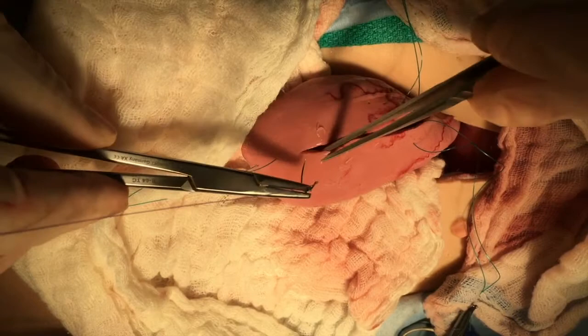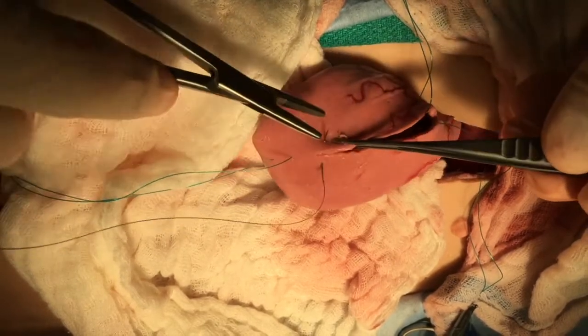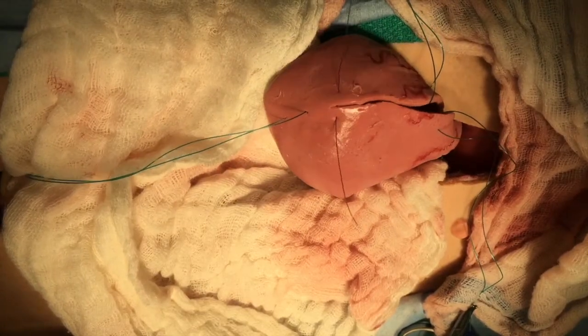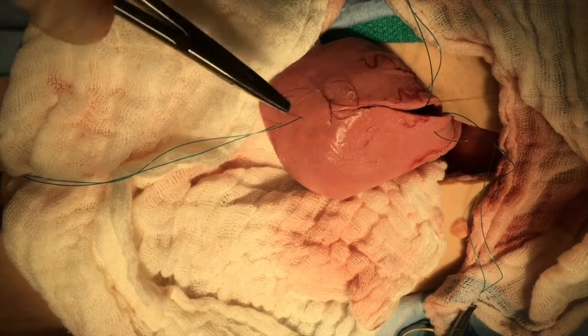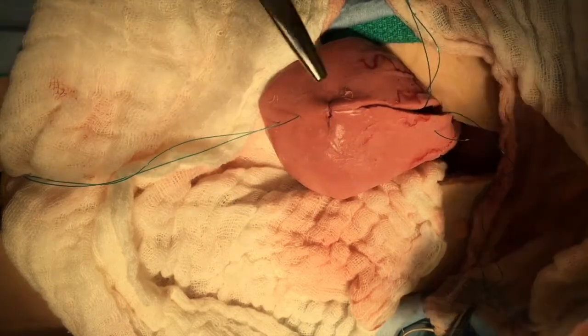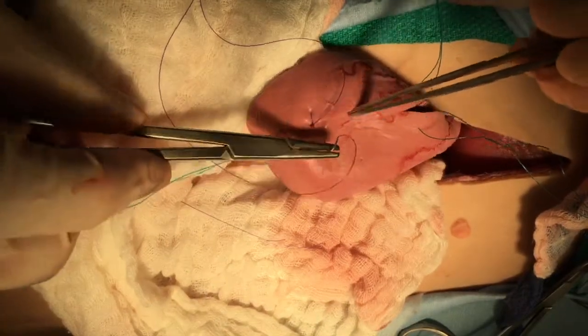In the male dog, we are going to perform both retrograde and normograde lavage of the urethra. Certainly you would want to consider normograde lavaging even in a female specimen that this model is trying to replicate.